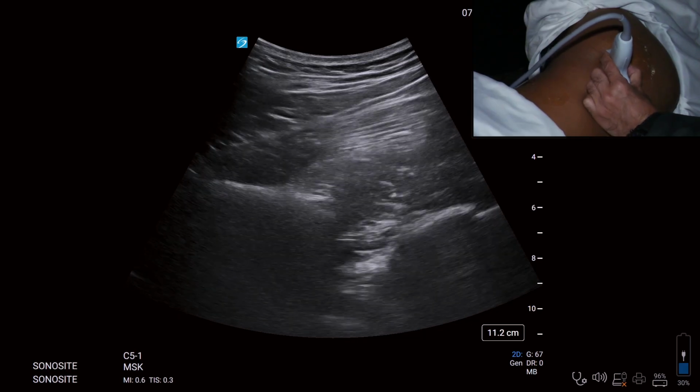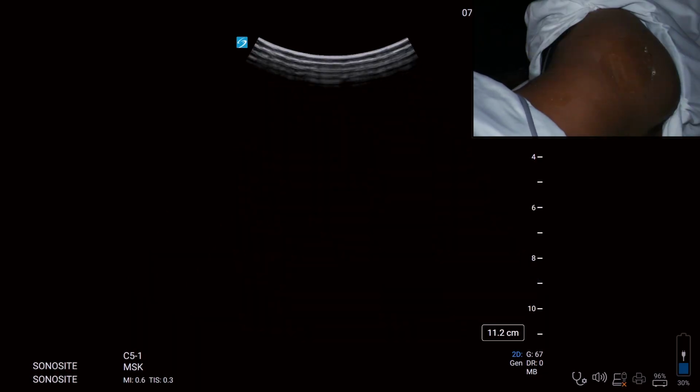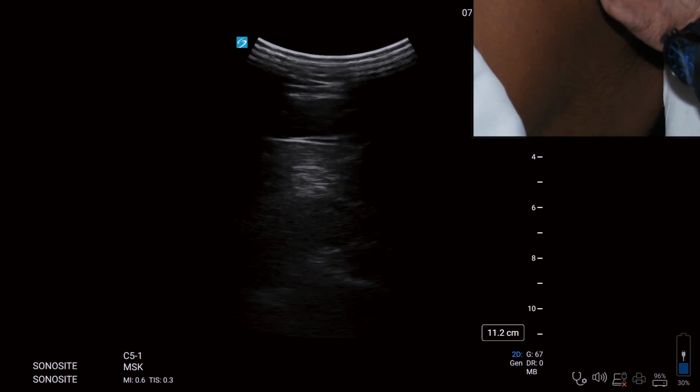Alternatively, if you are not able to see the posterior superior iliac spine, which is unlikely, Ahmed Ta in 2012 said, you can easily visualize the highest point of your gluteal cleft. Focus here, please. Gluteal cleft is visualized in each and every individual. So you look for the highest point of gluteal cleft, measure 8 centimeters, and keep your probe transversely.